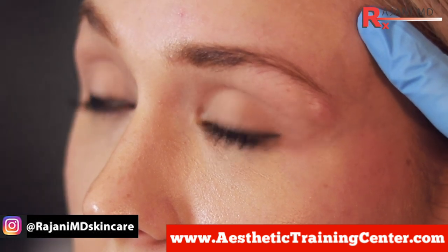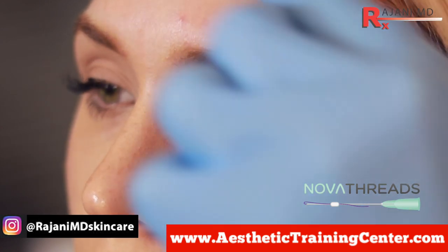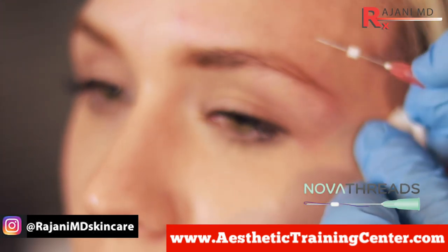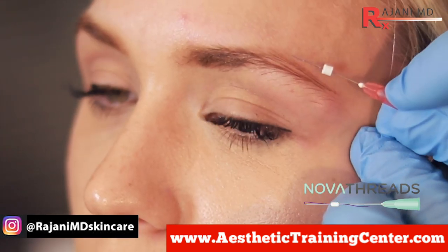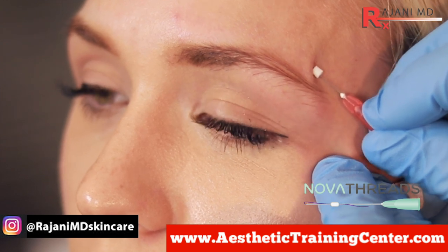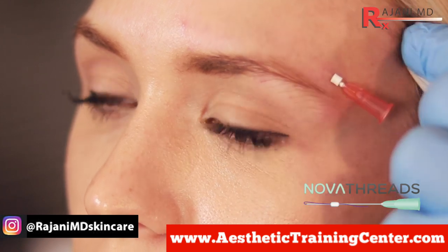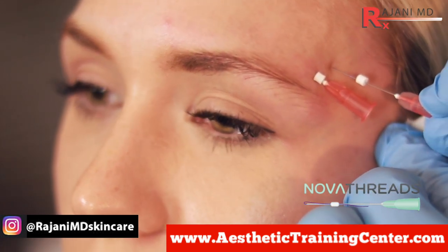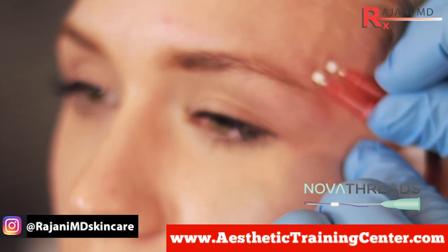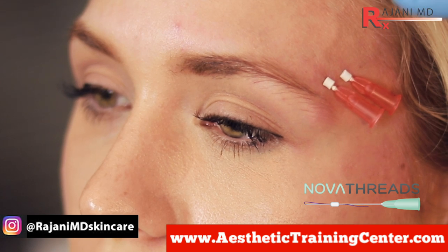Raise your eyebrow up again — you can relax. The temporal crest is here and you can palpate it right there. She fits the anatomical perfection by not having a lot of frontalis lateral to it. We see the vessels — I want some collagen stimulation above the brow. You can put them in the brow, and you can also use platelet-rich fibrin in the brow for hair growth and stimulation with or without A-cell. We're navigating around and injecting that thread, and we'll use a second one above it. Depending on the size you're using, you can use smooth, twist, or coil threads. I'm going just underneath the vessels that I see, trying to avoid them as much as I can. And you can leave them in for a second for hemostasis. I think we've done a reasonable job there by going underneath those vessels.